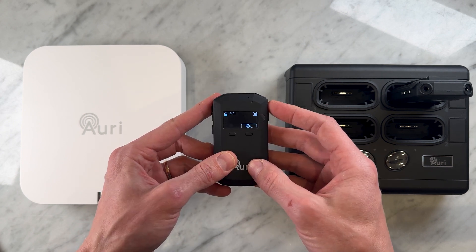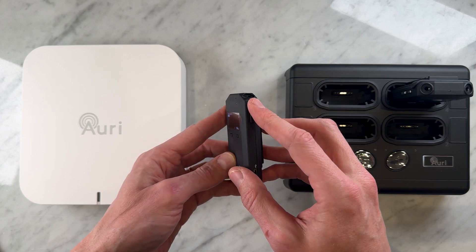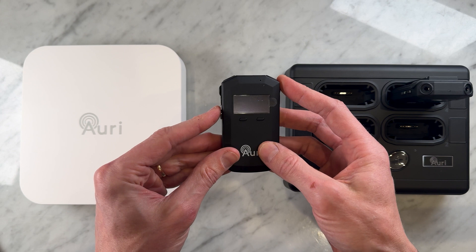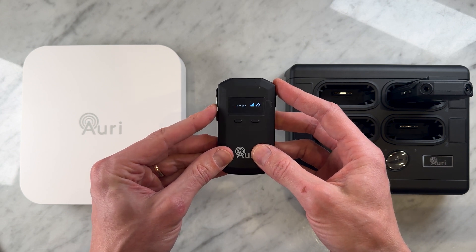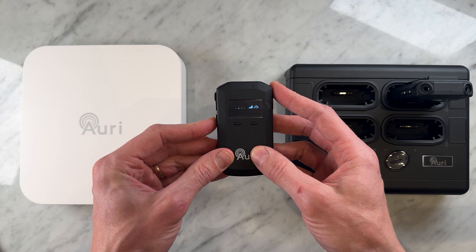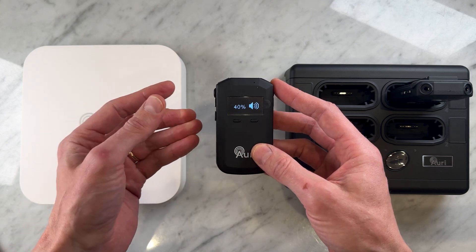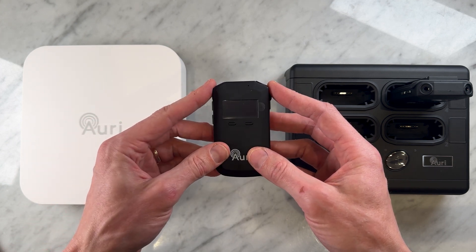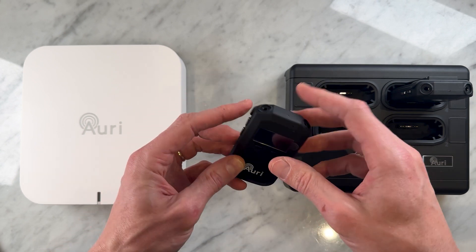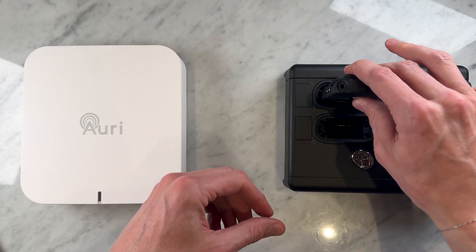In my opinion, it's the small things that make all the difference, with the display brightness adjusting itself based on ambient light. The controls couldn't be more intuitive, allowing for control over the power, volume up and down, and two multifunction soft buttons for easy operation. As far as charging goes, you'll have the option of either using a USB-C cable or via their dedicated docking stations.